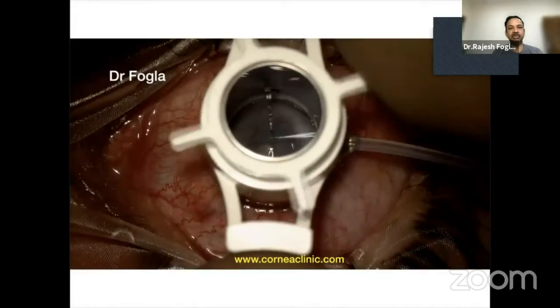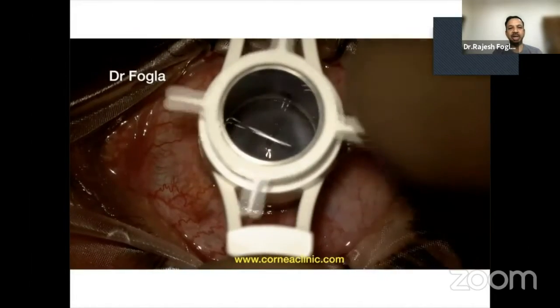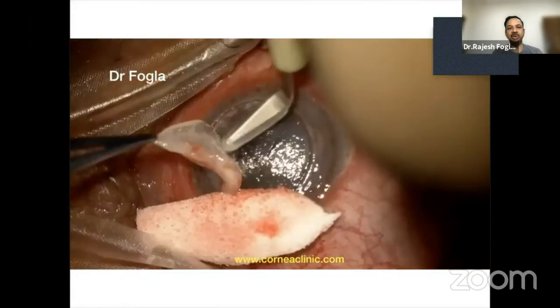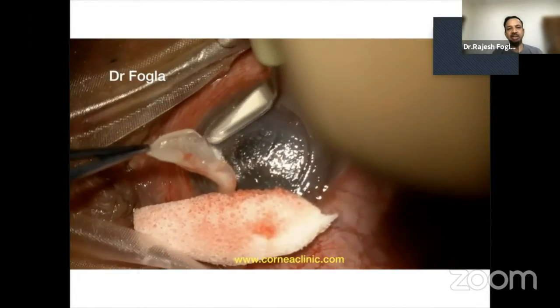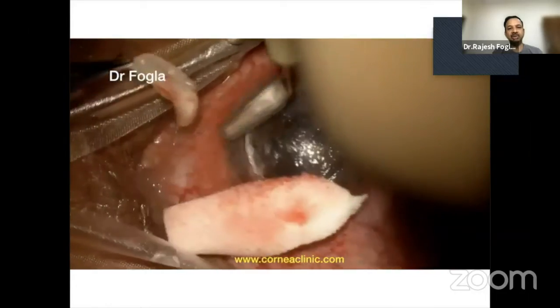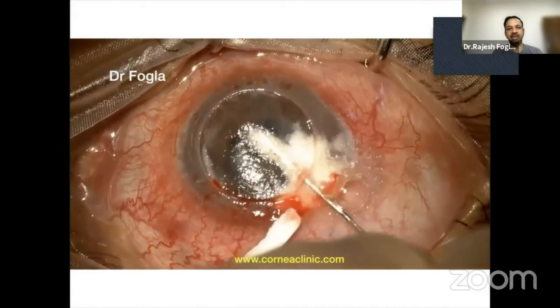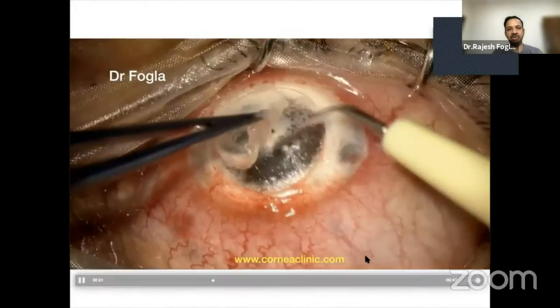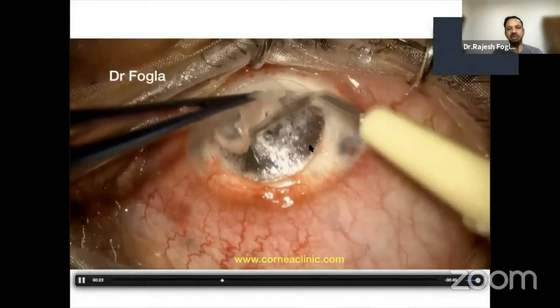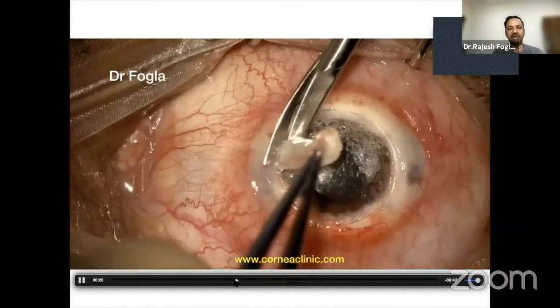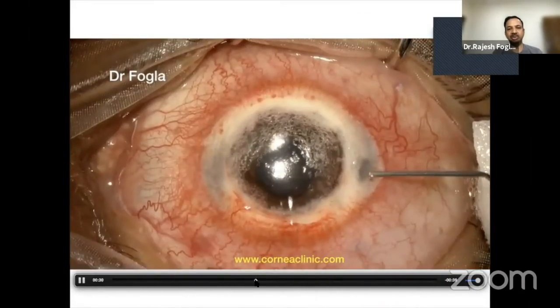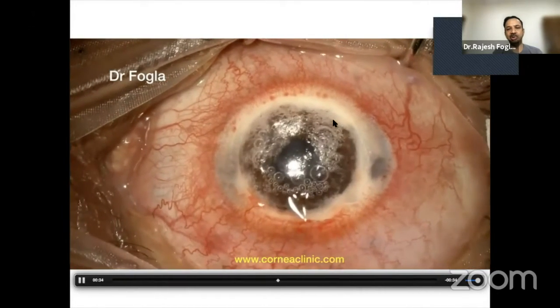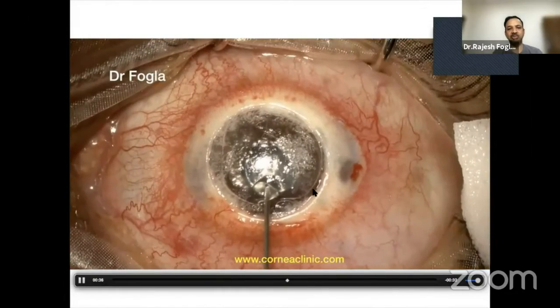I also had a similar patient with non-responsive Acanthamoeba keratitis. We were planning to do a penetrating keratoplasty because it was going quite deep, but decided to attempt a DALK procedure. As we injected the air, we did get a bubble, but we were not sure of the type because the whole stroma had become emphysematous. After debulking the anterior stroma, we could see the soft margin, unlike the dense margin you see with the type 1 bubble — so this was a type 2 bubble.